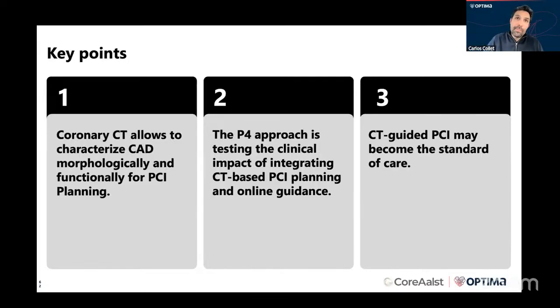And the second element of the P4 is the guidance, the online guidance, having the plaque or the map of plaque in front of you during the procedure. That really helps. And we firmly believe that if this approach shows to be beneficial, this is going to become the way they will be doing procedures in the future.